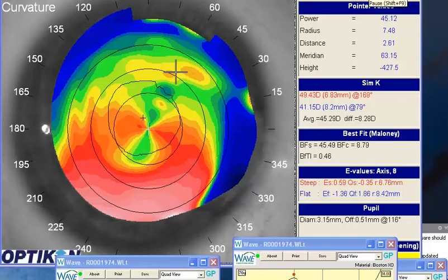I see from your case you have a challenging keratoconus patient who's got an asymmetric cornea with an inferior cone. Because of the amount of keratoconus, I see the patient's having trouble wearing their current gas-permeable contact lenses, and you're getting ready to order a Wave lens. However, I understand that you're a little hesitant to press that send button.